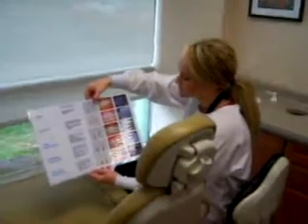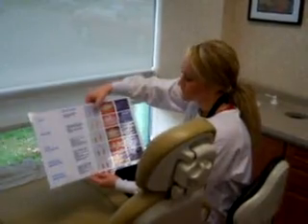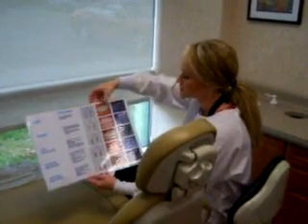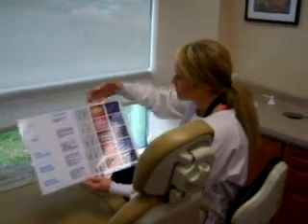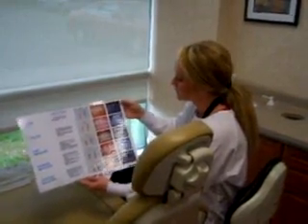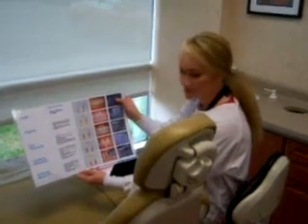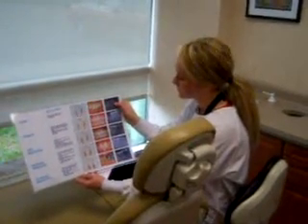In essence, what I'm really doing is I'm measuring where that bone level's at. So we drop down in here and we get numbers between one to three millimeters. We'll see the tissue's real light pink, no bleeding. And when we look at the x-rays that we took, we can actually see this enamel here again — that faint white line — and right where that enamel ends, you can see the bone is right there.